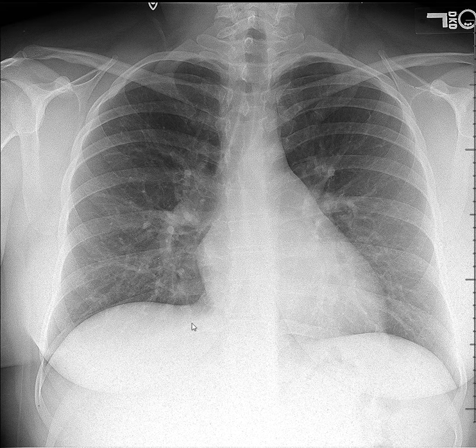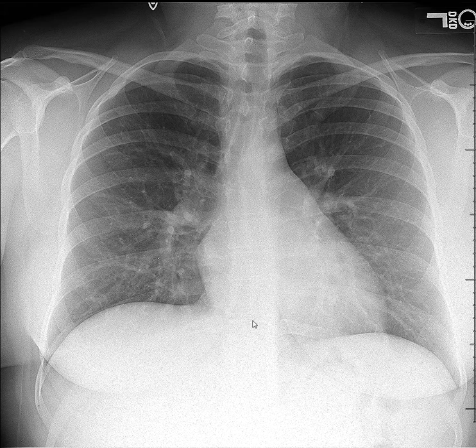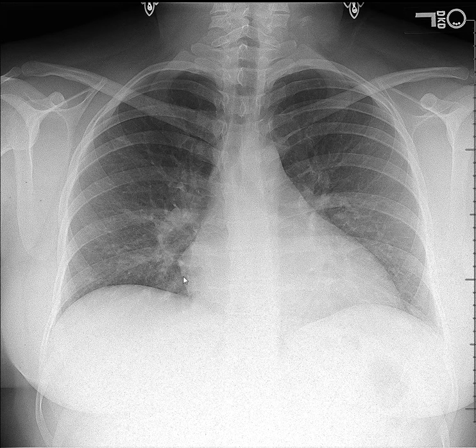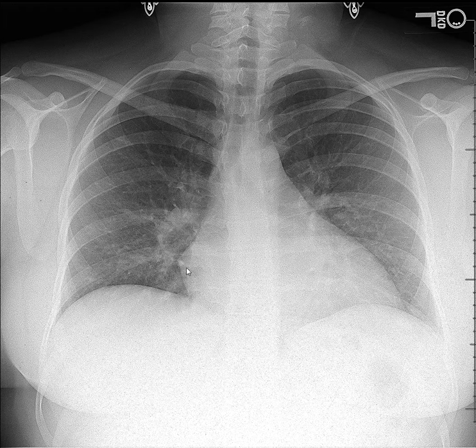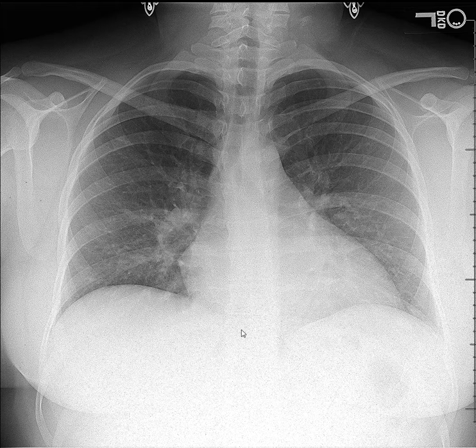Along the same line, normal heart size should be half of the thoracic cavity. When you have an abnormally low lung volume, the heart silhouette looks larger than half, and we may call that cardiomegaly — which is not true. That's another reason why we want to acquire the x-ray at end inspiration.